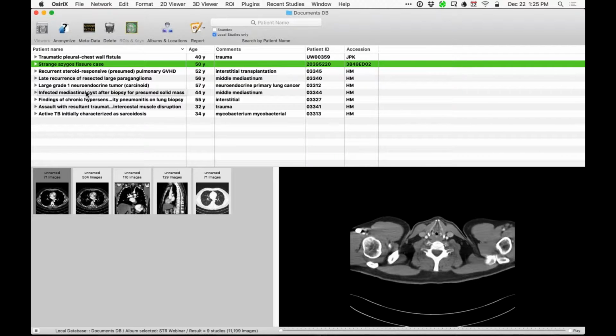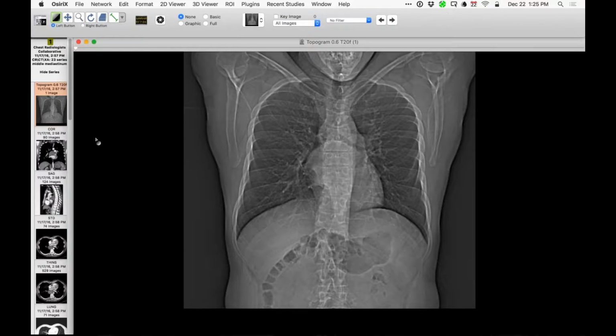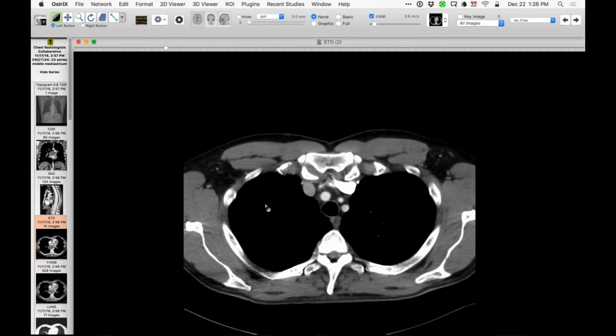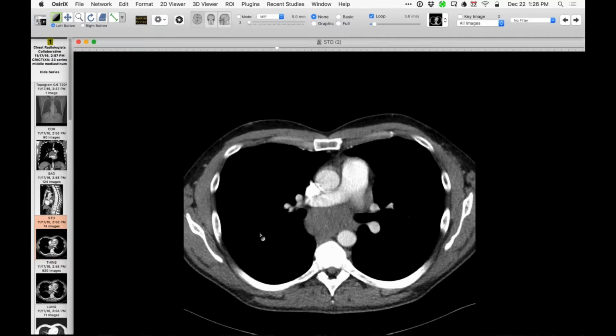All right, this one over here is an interesting case. So I'm going to kind of present it as it kind of happened. So here is what a radiograph would have looked like back when this person had something discovered back in November. And you can see that there is an abnormality here in the superior azygoesophageal recess subcarinal region, which is this thing. So I'll scroll through that and give you a feel for what this looks like.